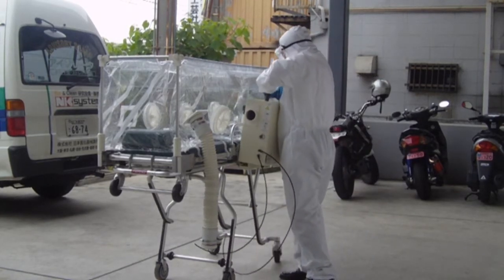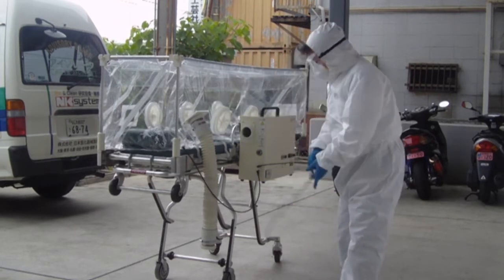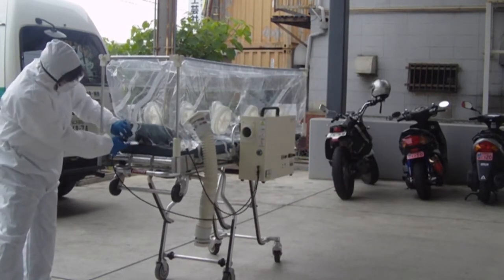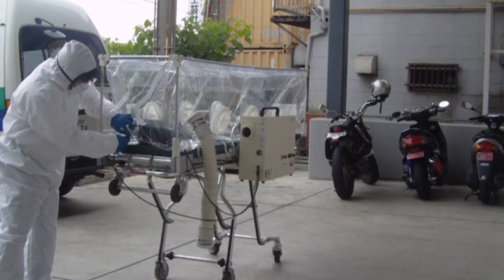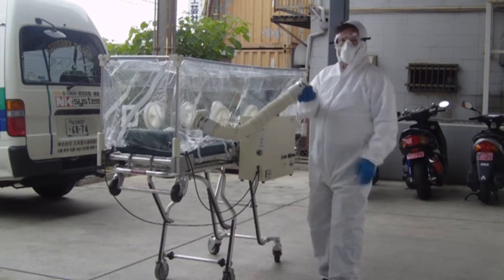Next, the electrical fan box is installed in the sidearm of the stretcher. The air pump tube and exhaust hose are installed in the vinyl capsule. The air tube and exhaust hose are installed in the electrical fan box.